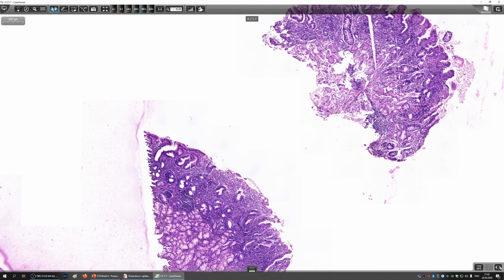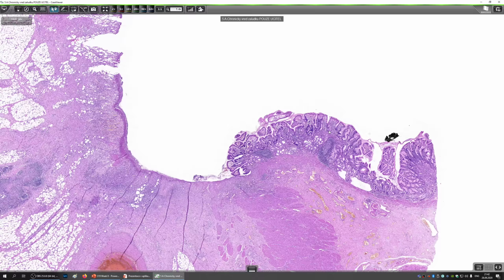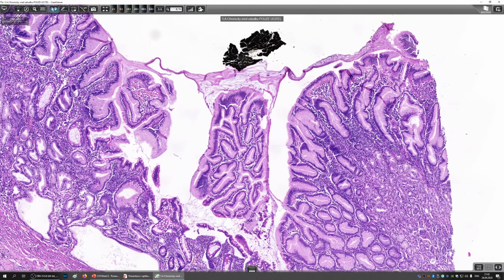And let's check what happens if this festers for a longer amount of time. I'm going to talk about chronic ulcers of the stomach. So this is another beautiful case. This is a surgical resection specimen. So here we see mucosa of the stomach of the pyloric type. You see no corporal glands. You see the picture is very similar to the previous one.